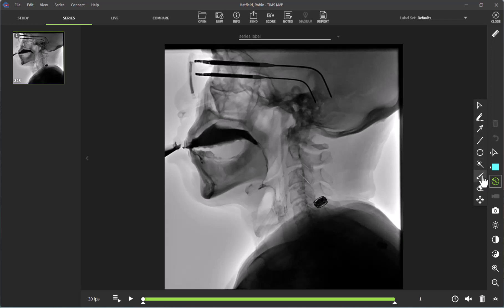For this video, we are going to go ahead and start with our magic wand. I am going to start measuring by selecting the bolus when it is in the oral cavity, as it is nice and cohesive and easy for us to outline.